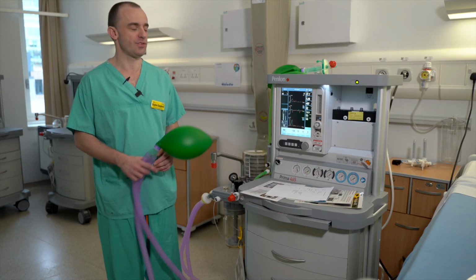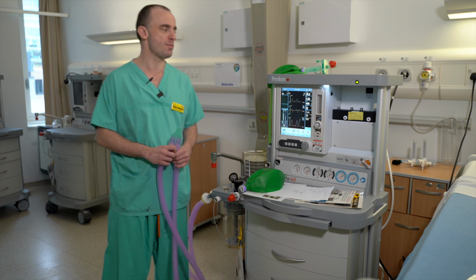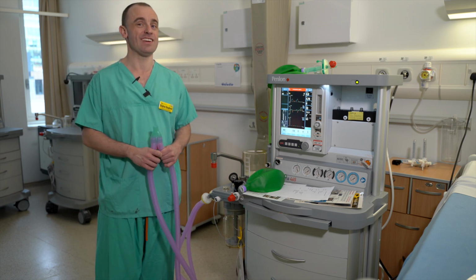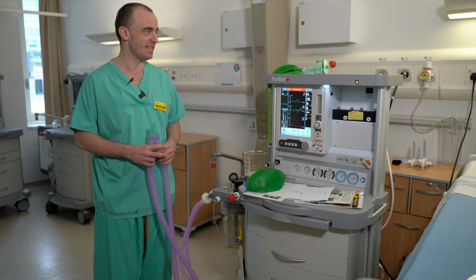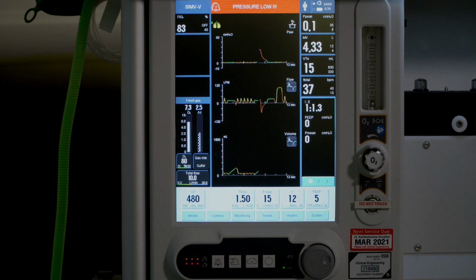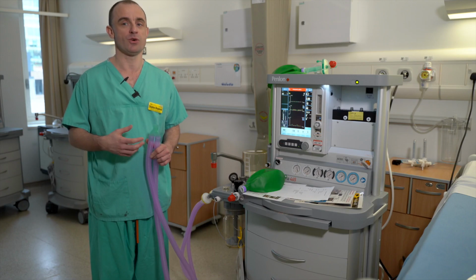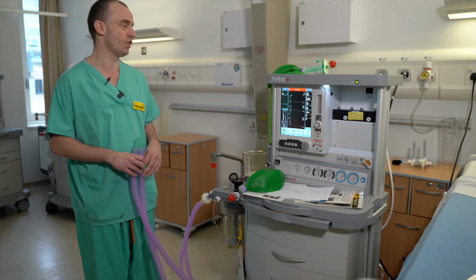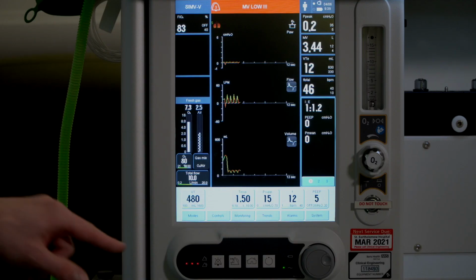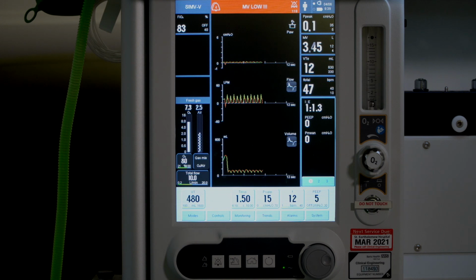Coming back to alarms, you'll see that there are auditory alarms which the ventilator will make. They all sound very similar. So this is the alarm for the pressure low, but you get the same tone and same volume for oxygen alarms or for battery failure. If you want to silence the alarm, the button here at the bottom left is the alarm silence.